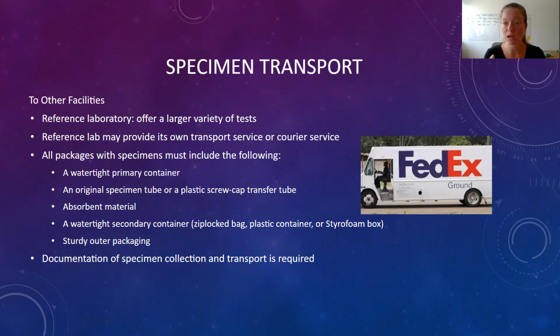Our packaging, of course, has got to be sturdy. And just like with the courier, if we're going to send it in the mail, we as phlebotomists have to know if it needs to be packaged with a cold pack or dry ice, for example. It's really important that we document all steps in the packaging and transport process, because if there is an issue with the lab or specimen when it arrives, it needs to be able to be tracked back so that we can look at errors along the way and figure out how can we prevent any errors from happening again, or where did this error take place.